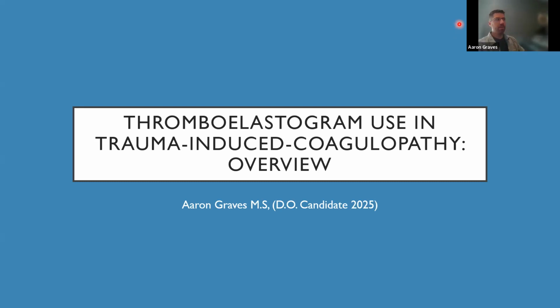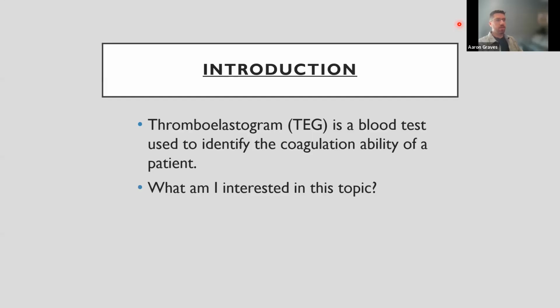Thank you, Anne-Marie. As you mentioned, I'll be talking today about the use of thromboelastography in trauma-induced coagulopathy. Just off the bat, to give you an idea of what thromboelastograms are, or TEGs, as I'll be referring to them, they're blood tests used to identify the coagulation ability of a patient.